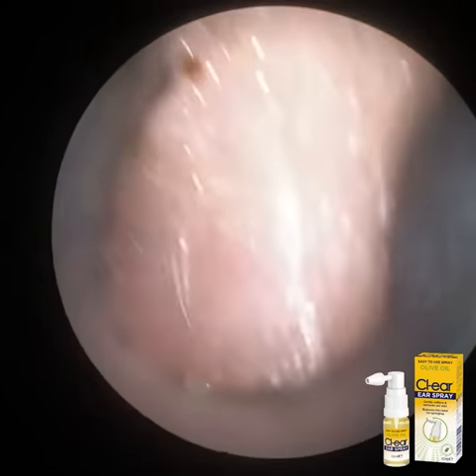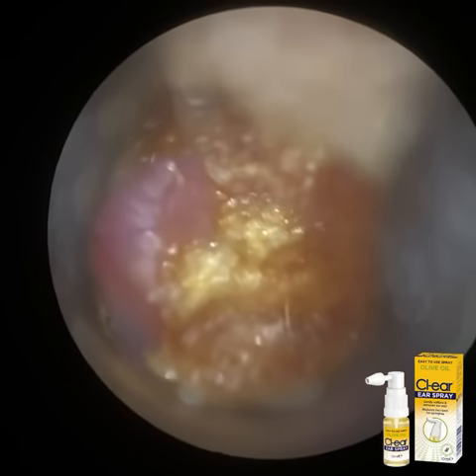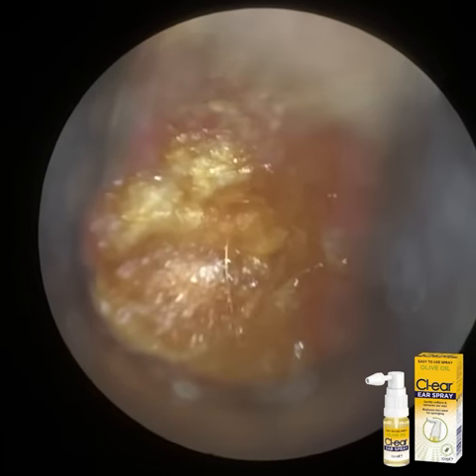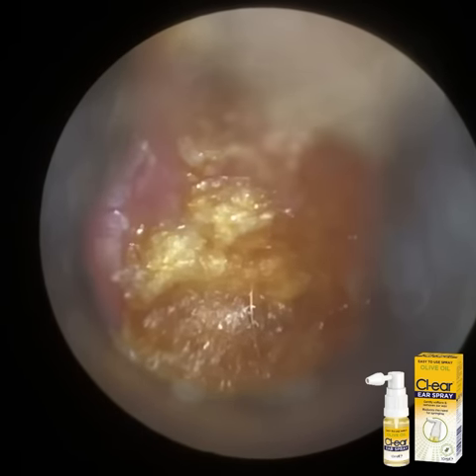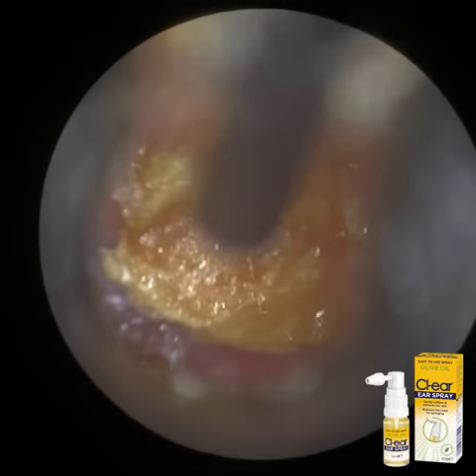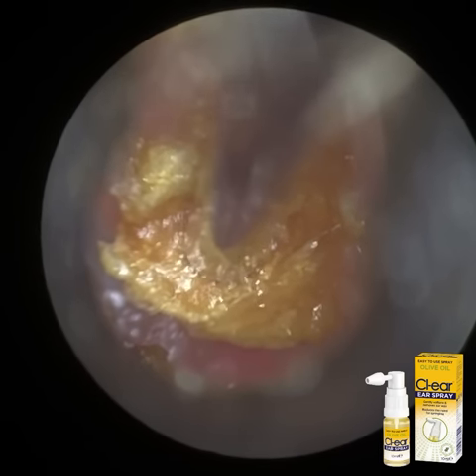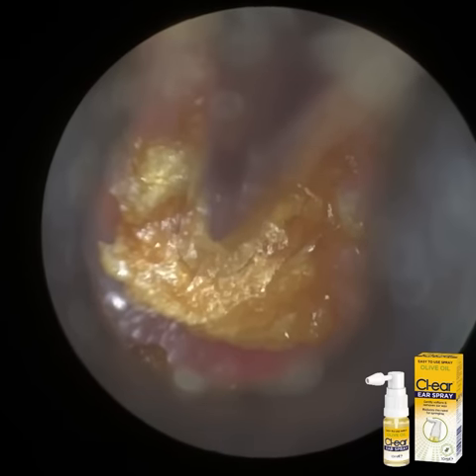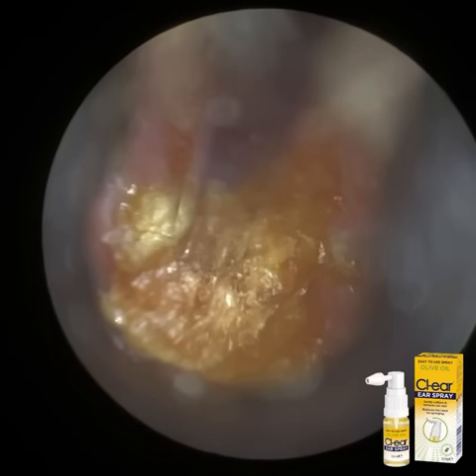But yeah, an endoscope in terms of optics, you just can't compete, but it is a bit more skillful to use an endoscope because you're having to stretch and straighten the ear canal using the side of the endoscope. So it requires a lot of coordination between your two hands, so bilateral integration. With the WAXscope, it comes with a speculum, so that helps to straighten and widen the ear canal, so it's a bit more user-friendly.